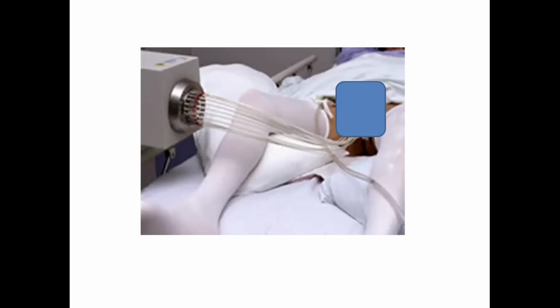About 2 weeks after the brachytherapy is done is when people get their external beam radiotherapy treatment. So the vast majority of patients having high dose rate brachytherapy are having it in combination with external beam. In other words, it's given as a boost to try and increase the dose to the prostate where the vast majority of the tumour is and the key components of the cancer are. But they also need the safety margin of treating around the outside of the prostate, and possibly sometimes treating the pelvic lymph nodes as well, which is what happens with the external beam radiotherapy.